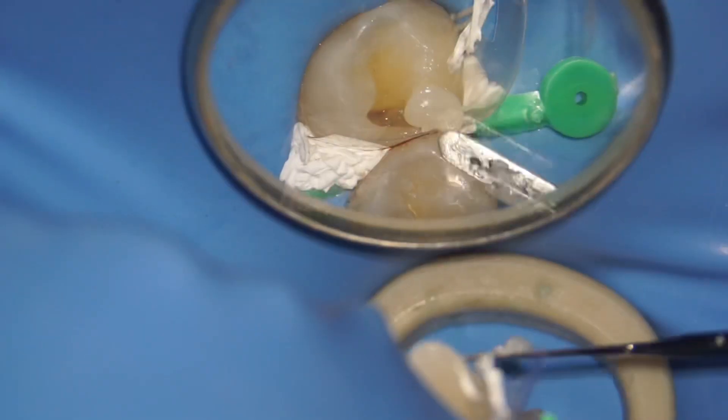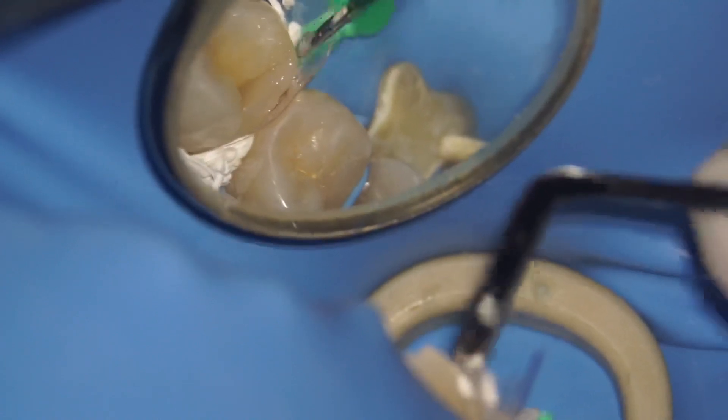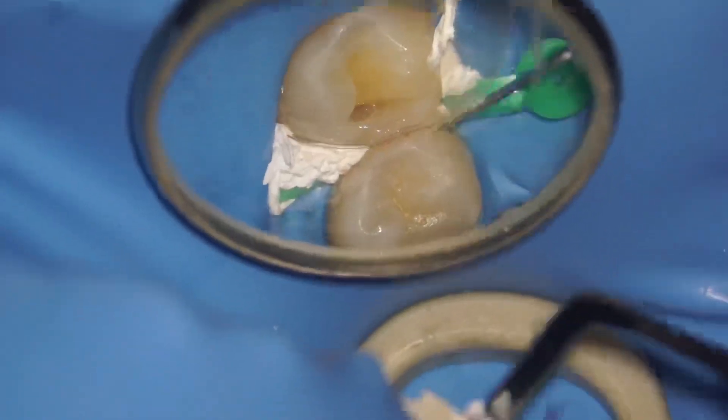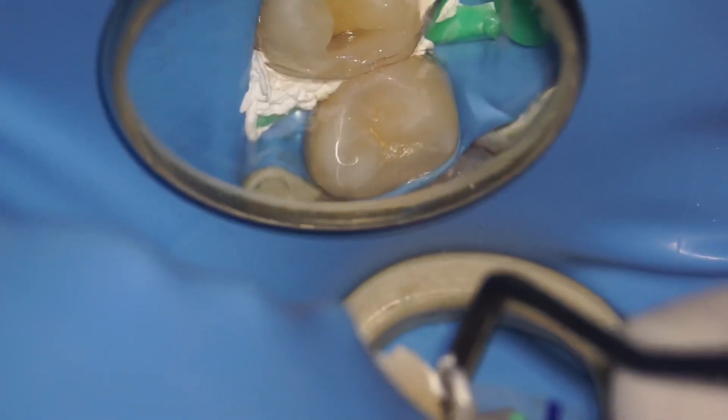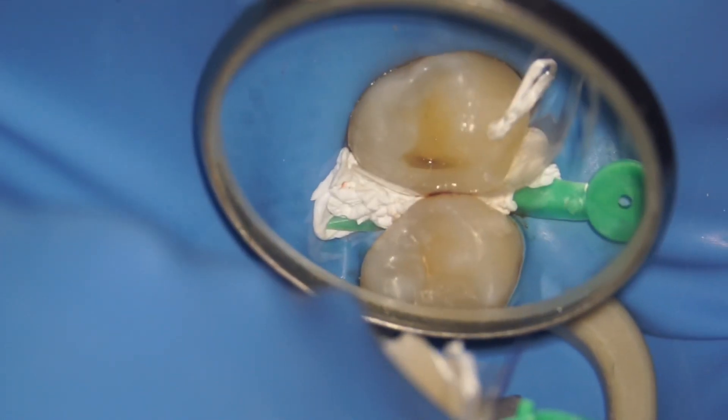I'm going to ask my dental assistant to cure. After that, I'm going to build the buccal half of the premolar. After adapting well and removing any excess, I felt the matrix was not tight enough, so I used another instrument to pull it towards the distal against the 1,5 so that I have a better adapted margin.